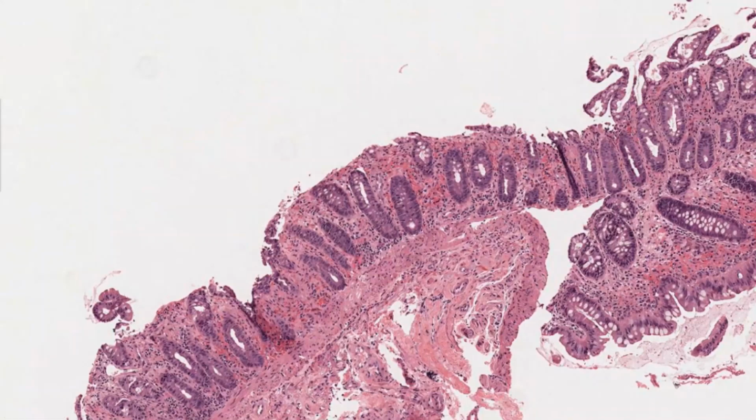This is not the right color for our lamina propria. The lamina propria in general doesn't have a lot of collagen fibers, but here it is pink. It has a little bit more collagen, and you can see in between there is a lot of red blood cell extravasation, and here you can see some crypt bifurcations telling you that there are some regenerative changes happening. So all of these are part of the problem.